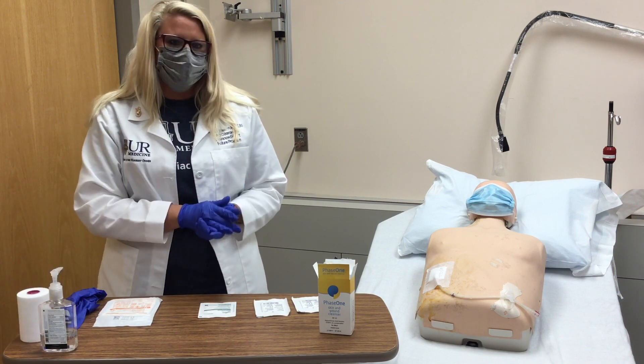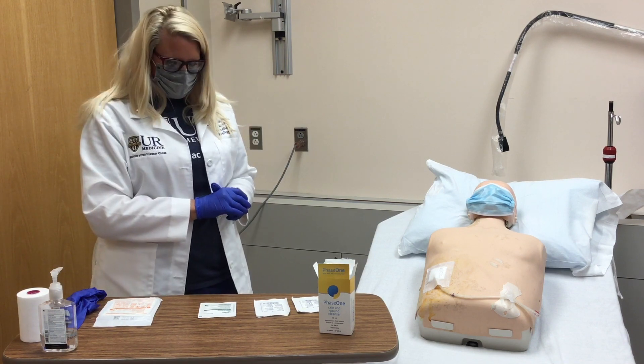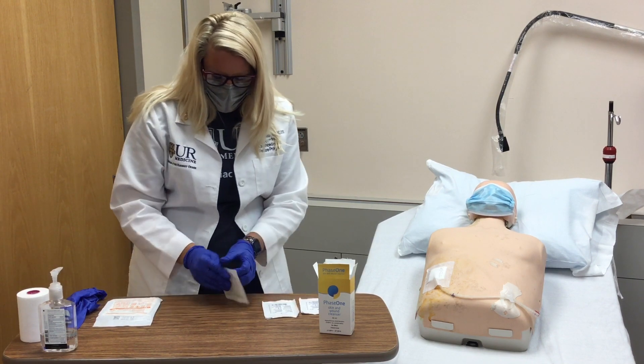If Phase One is irritating to your skin, you may also use a bottle of saline. Carefully open the split gauze and two gauze pads.